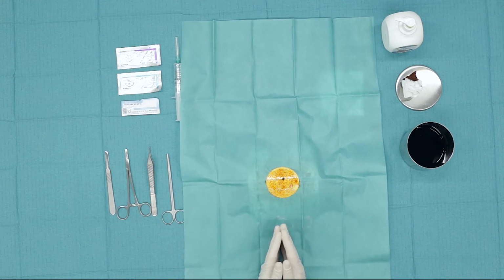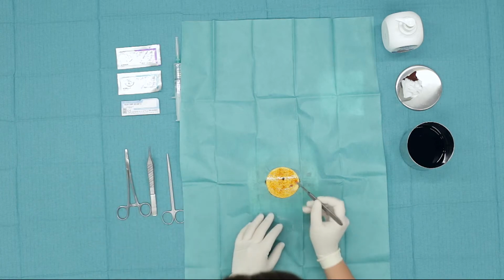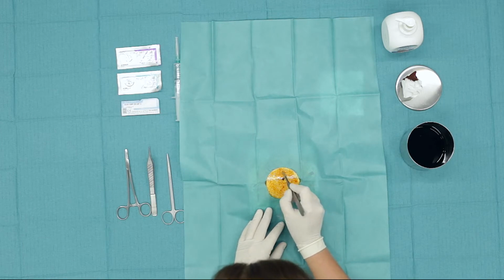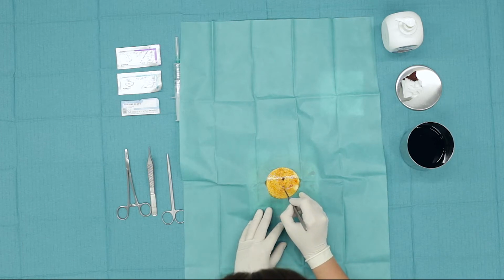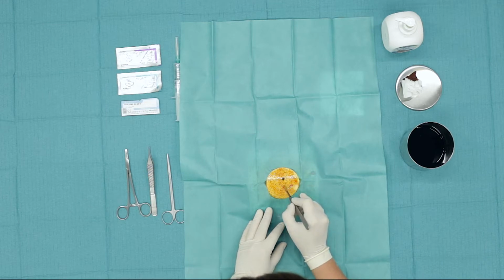The incision that will be made in the skin is spindle-shaped. It follows the direction of the skin folds, and the ratio of the incision is 3:1 in length to width. The ratio is important for the surgical wound to contract later.